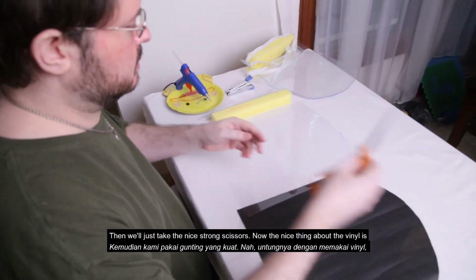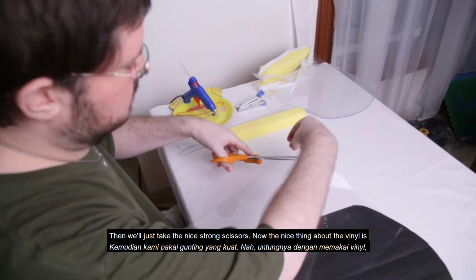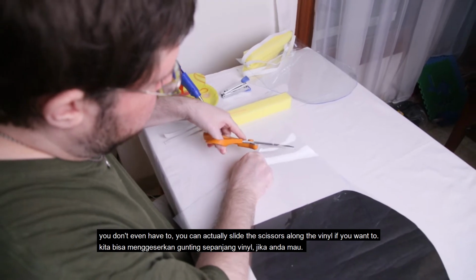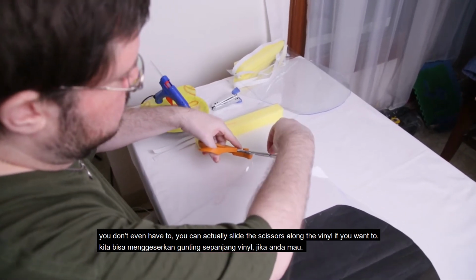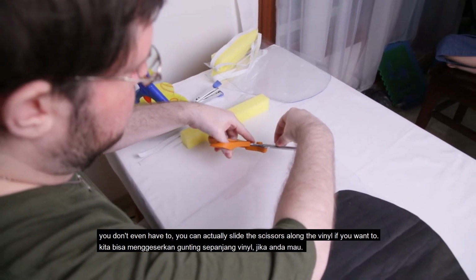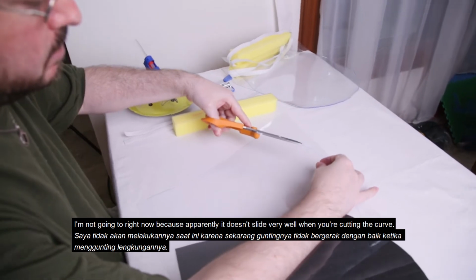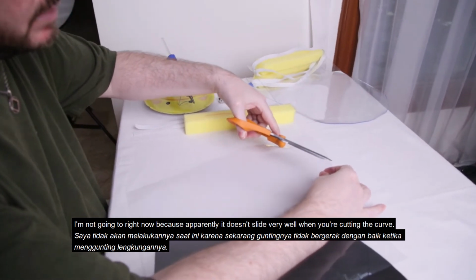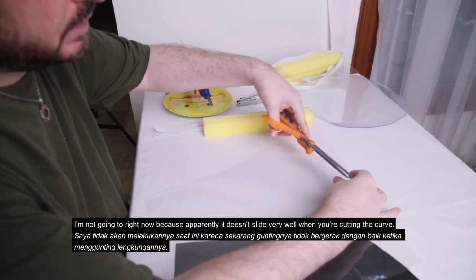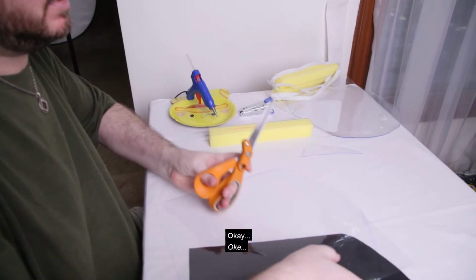Then we'll just take the nice strong scissors. Now the nice thing about the vinyl is you can actually slide the scissors along the vinyl if you want to. I'm not going to right now because apparently it doesn't slide very well when you're cutting a curve. Okay.